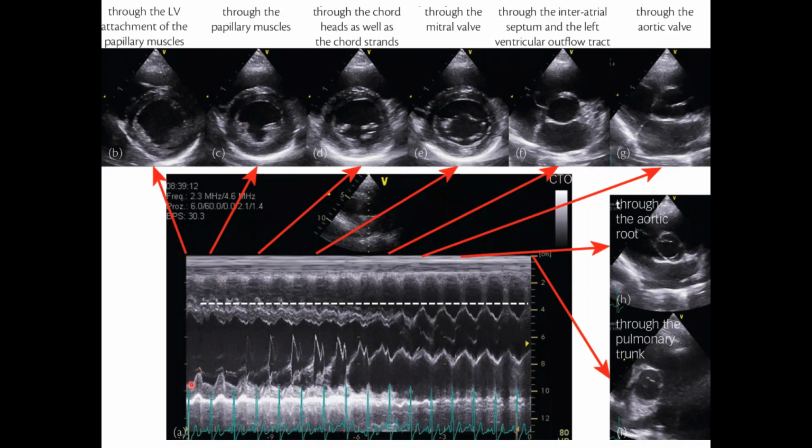So if you wanted to know the acceleration or the jerk or higher order derivatives of the motion of this piece of tissue, you would look at this curve, right? And so we do that for a couple of beats. So we've got 2 heartbeats here. It's coming in, filling with blood, coming in. Now we're moving into a slightly different location, more towards the top of the heart as we move this way. And then these features come in, and these are valves that have come into the field of view here, right?